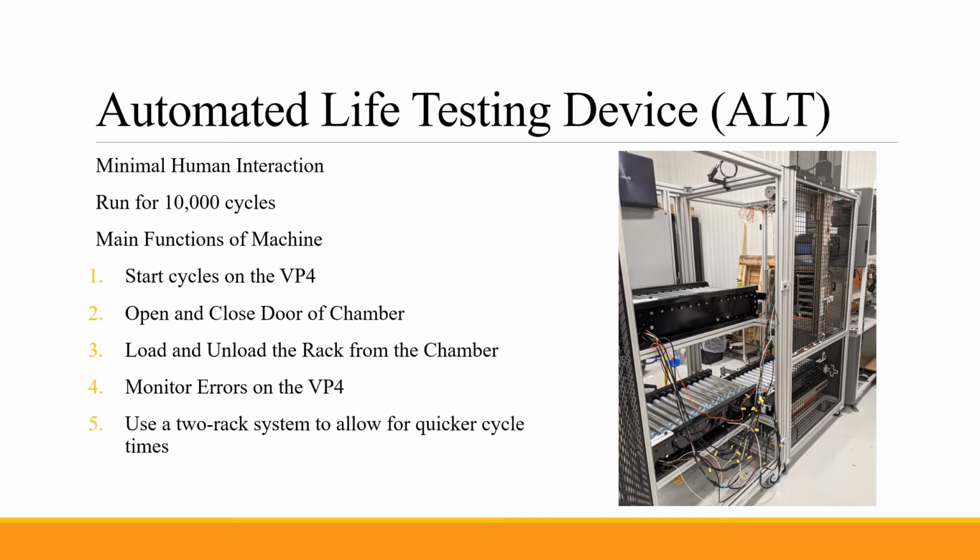The machine that we created was called the Automated Life Testing Device, shortened to be ALT. We wanted this machine to have minimal human interaction and be able to run for 10,000 cycles, because we wanted the VP4 to approach failure before our machine failed. Some of the main functions of this machine were to start cycles on the VP4, open and close the door of the chamber, load and unload the rack from the chamber, monitor errors on the VP4, and use a two-rack system to allow for quicker cycle times, so one rack may be cooling while the other rack is in a cycle.